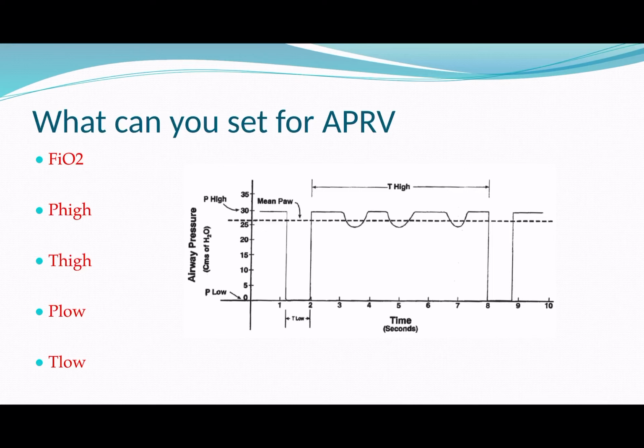Similarly, generally speaking, APRV is done in a spontaneous mode of ventilation. This is very difficult to replicate in patients that you try to do APRV on an anaesthetic machine, because again the valves are not quite as advanced as you get on an intensive care machine.